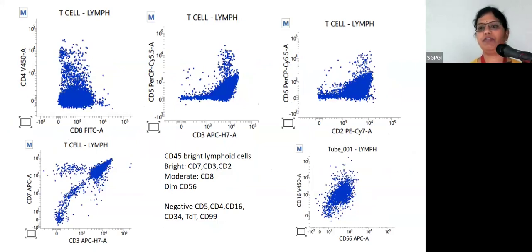So we can follow the case clinically, because as we read in the literature, hepatosplenic lymphoma is an aggressive lymphoma. Will it go away or will it come back? Yes, we cannot rule it out. So yes, Dr. Jasmita is also there. Please, your inputs as well.